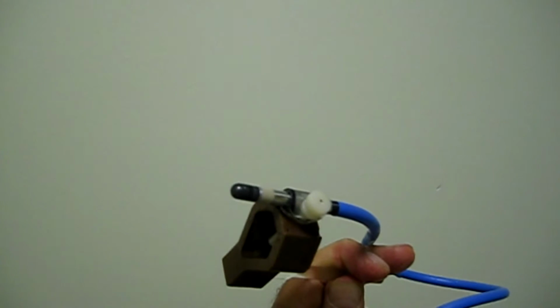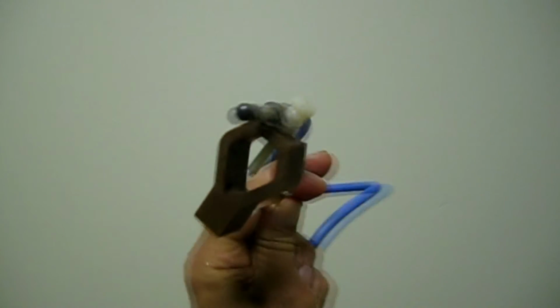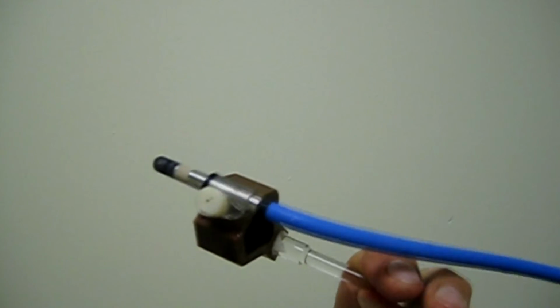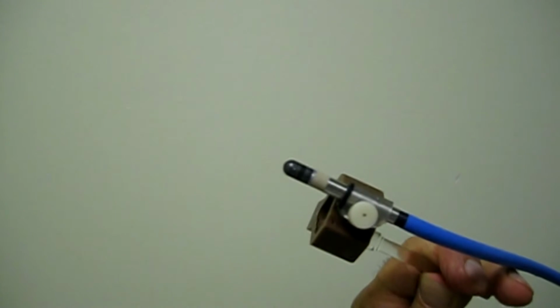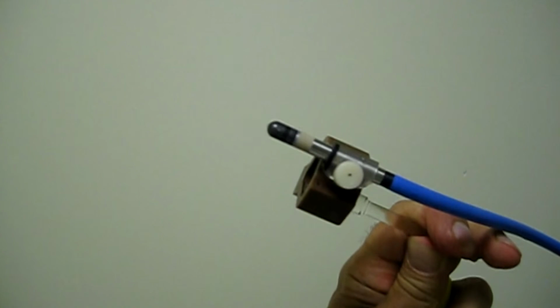In this case, we use a smaller ionization chamber, 0.125 cubic centimeter, in order to reduce the correction factor for chamber dimensions. In the standard ionization chamber holder of the TNMC water phantom, a narrow groove was cut to fix the ionization chamber in the correct angular position.